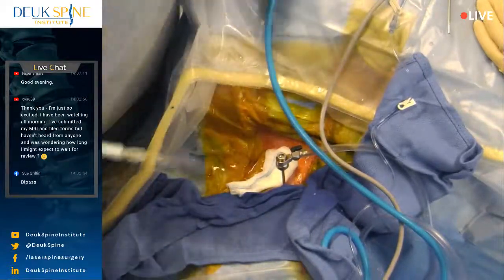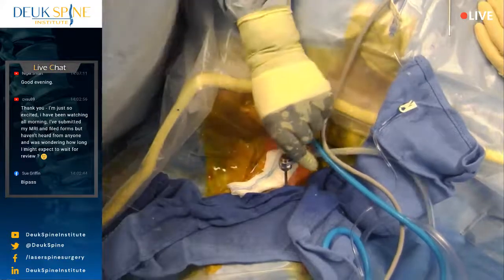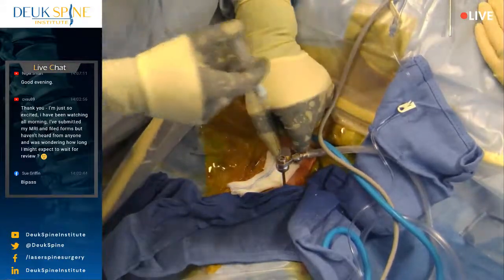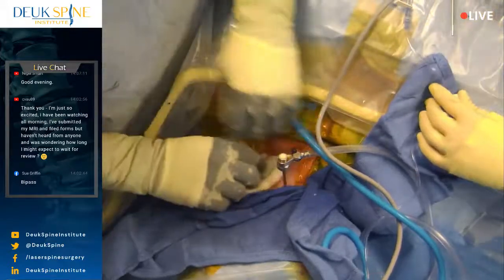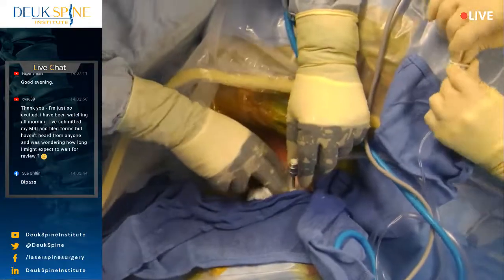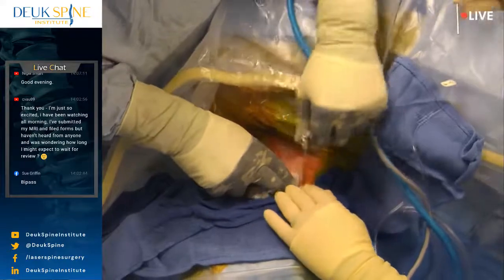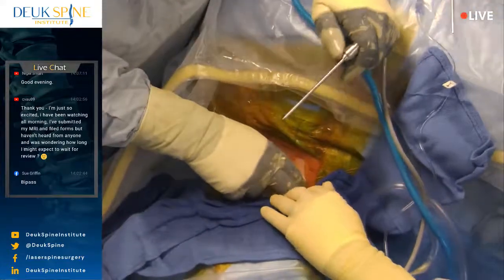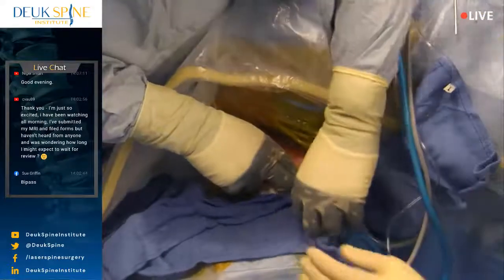This patient has had a history of post-op nausea, vomiting, so we're just going to have to see how she's doing in an hour from now. But that's why we were talking about the nausea stuff earlier. All right, I'm going to take this tube out, put a little bit of pressure on the incision, and then I'm going to show you how we did the surgery. Pull the tube. Let me have that tube.